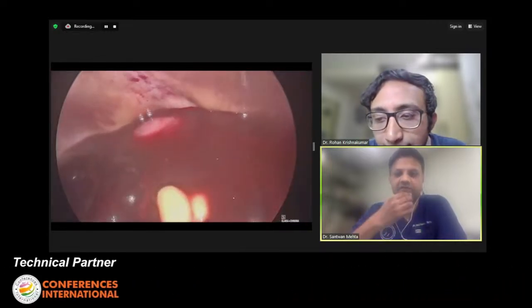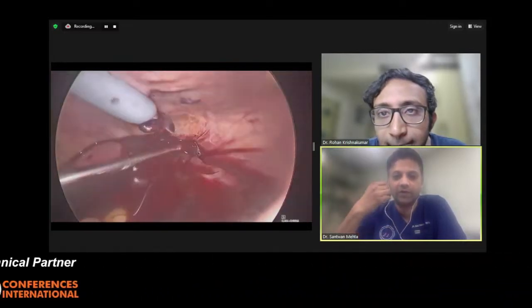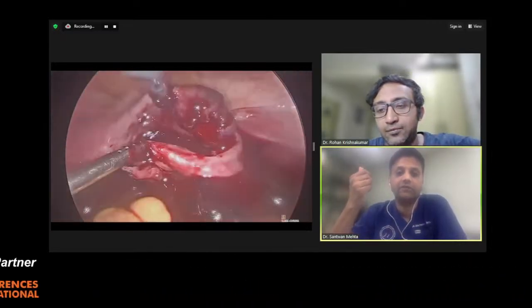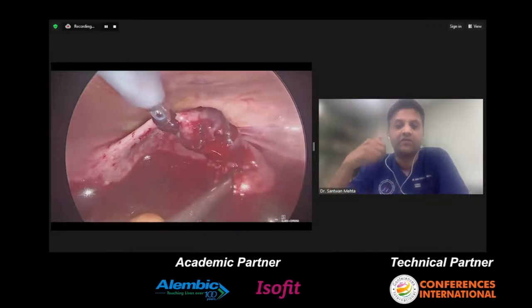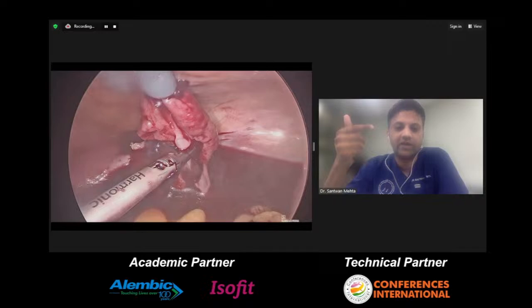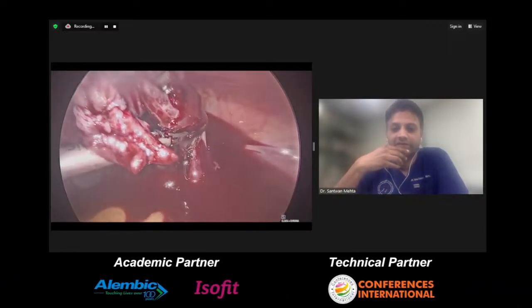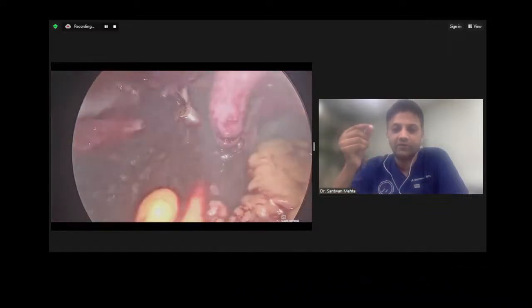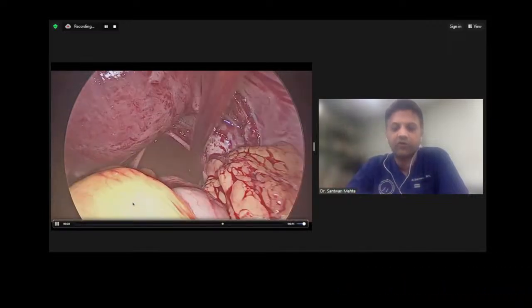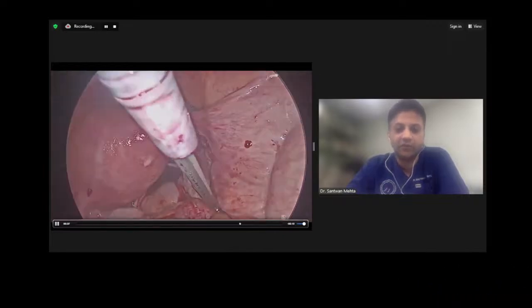Now, as you can see in this video, gone are the days when for the ectopic pregnancy we had to resort to laparotomy. Even if there is a huge amount of hemoperitoneum, with a good anesthetic team and good blood bank availability, we can resuscitate the patient and go into the abdomen via laparoscopy. With the good hemostatic vessel sealer machines available, we can just target the ruptured ectopic area, control the hemostasis, and beautifully come out of the surgery. The patient usually does fantastically well within a few hours only.